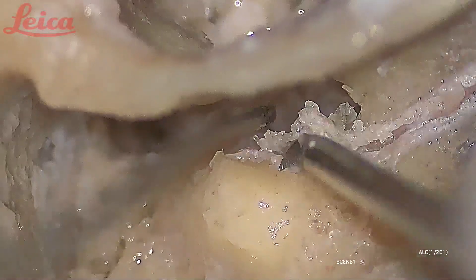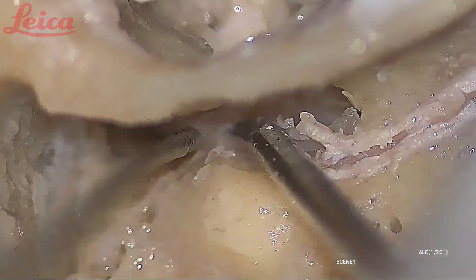Now I am coming close to the horizontal segment — you will see that the sheath becomes more thin here and gets easily sliced. Now you see it is so thin and transparent and it gets easily lifted up.